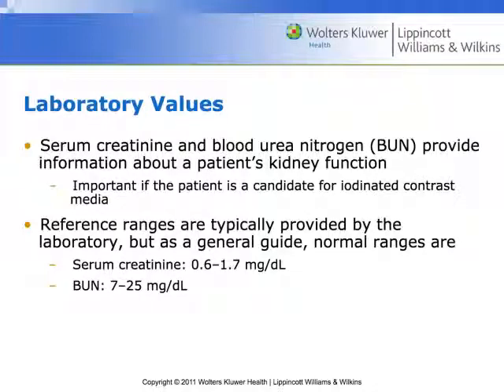BUN is critical, but creatinine is much more critical. Depending on our institution, we will be looking at a creatinine range, or we will be calculating a GFR, what they call an eGFR, from the creatinine. Either way you slice it, you need a creatinine.